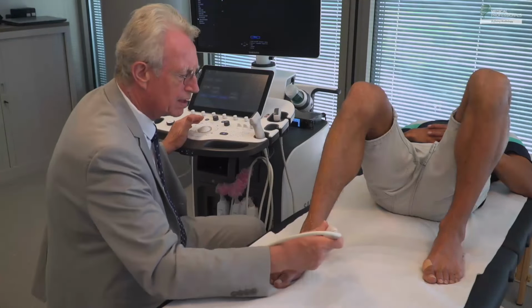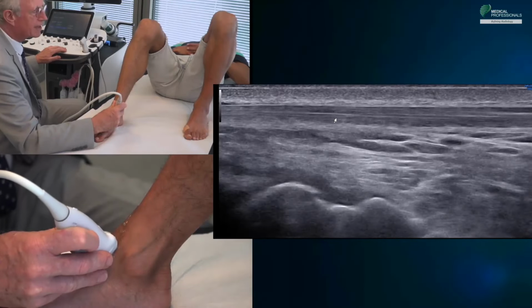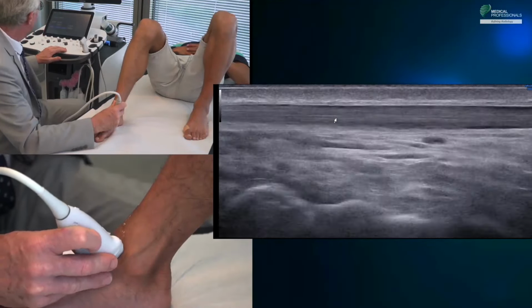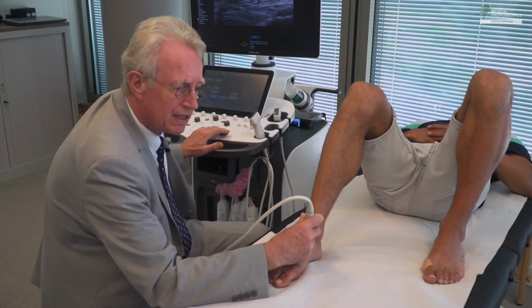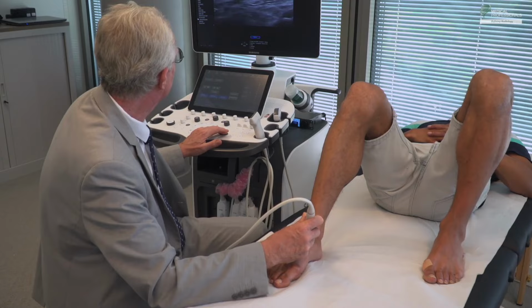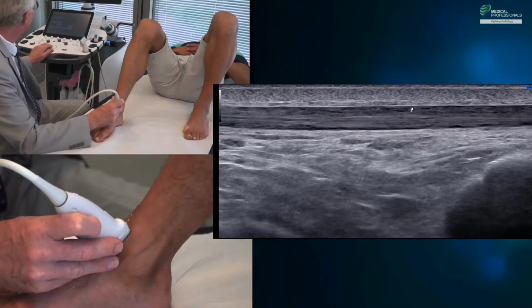This very superficial tendon is a trap because its 2 main pathologies are poorly described by the patient. The first is the rupture of this anterior tibial tendon. This rupture usually occurs in elderly patients following mild trauma and does not prevent dorsiflexion of the ankle. This is why this rupture goes unnoticed. In addition, in the event of a rupture, the patient often presents for a mass corresponding to the retracted tendon that becomes stuck under the extensor retinaculum.